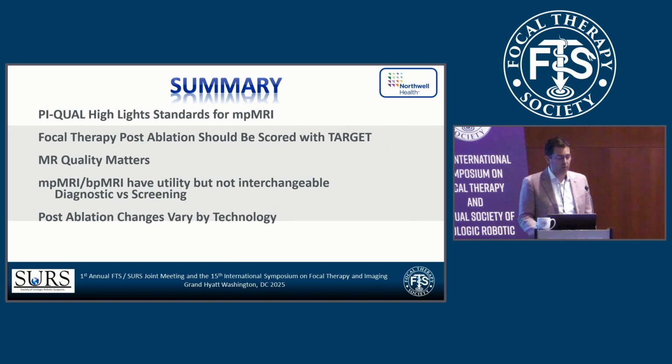But in summary today, PIQUAL highlights the standards for multiparametric MRI, which I went over, which is key. Focal therapy post-ablation should be scored with a target criteria. MR quality matters. Multiparametric MRI and biparametric MRI have utility, but they're not interchangeable. So please remember the difference between a diagnostic test and a screening test. And post-ablation changes vary by the technology employed.